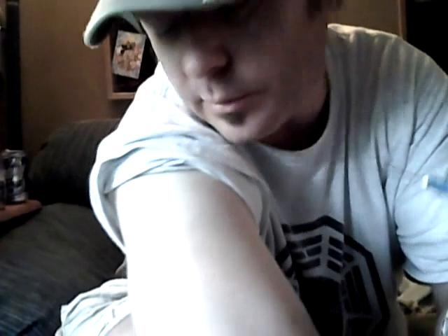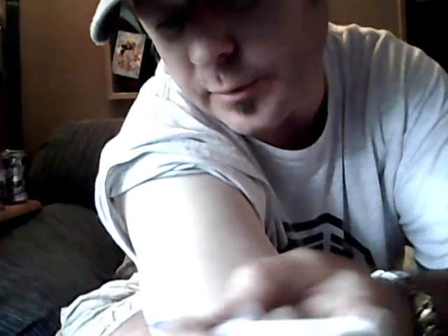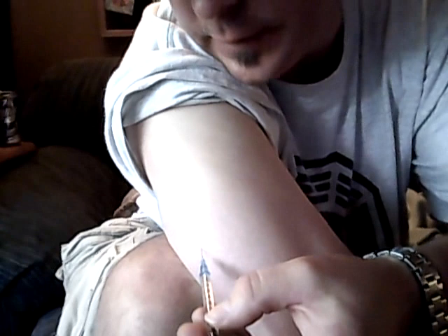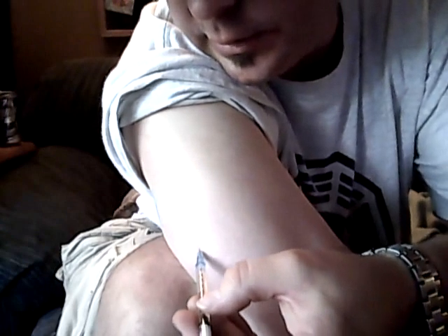So now I have my needle, and I can uncap that. These needles, you'll notice, will have a bevel on them. You can't see it with this camera at all, but you can tell which way the hole is as far as which way it's cut. And usually you do a bevel up. This is a subcutaneous or sub-Q or SQ injection, so the bevel goes up just like you would giving somebody an IV. And I have a tendency to go whatever angle works. So for me right now, the angle going up is easier. I can see what I'm doing. And a 45-degree angle, and that's pretty much in.